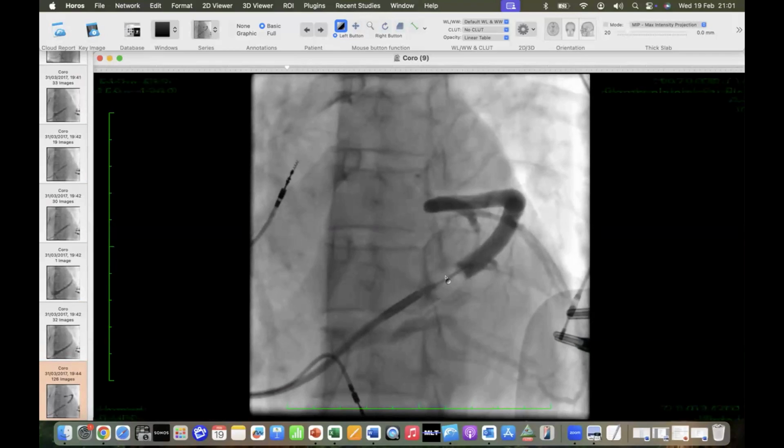Remember the veins drain this way, yeah? So we have to occlude this and then push firmly in this direction, as long as you're not too aggressive. There are a few branches in this LAO position. There's this thing called an anterolateral branch, but it drains a relatively lateral position.